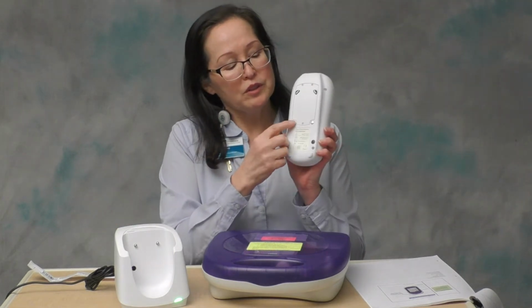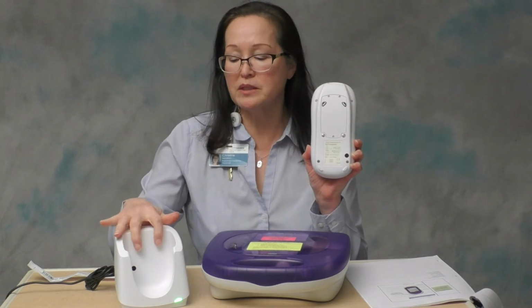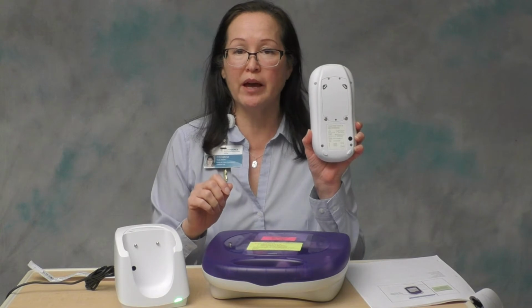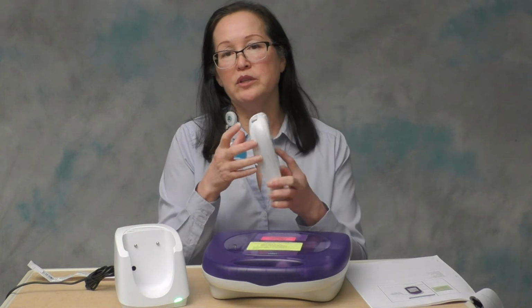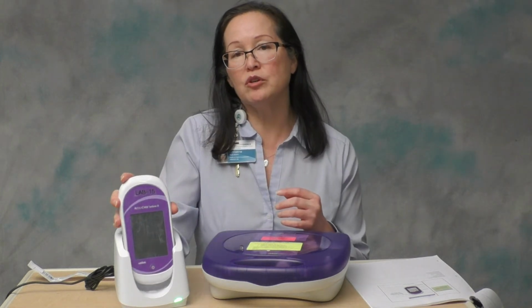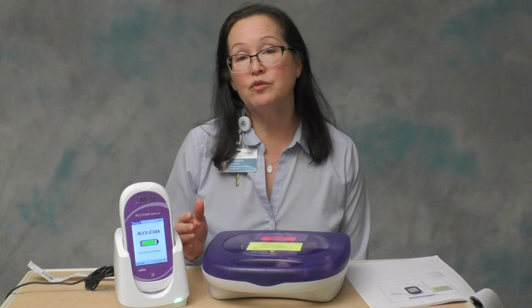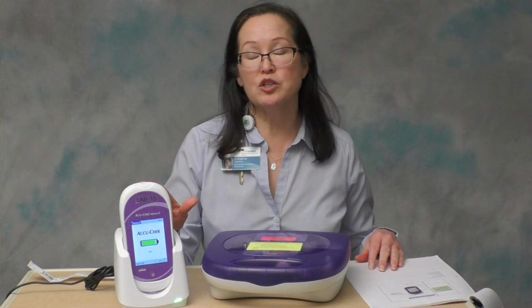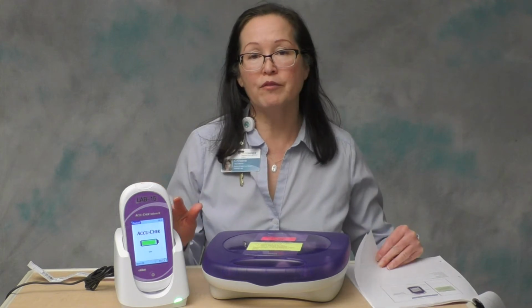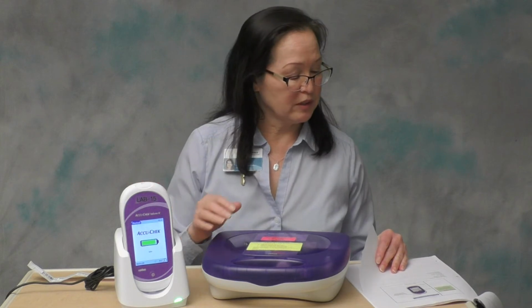On the back of the meter, you'll see two metal contacts. This is where the meter makes contact with the base to recharge the battery. This is really important to make sure that these metal contacts remain dry when you redock the instrument. If there's any moisture on the battery contacts, a rust film can develop and the contacts can start to corrode. And the rust film will actually prevent the battery from recharging correctly. So just make sure that you dry off those battery contacts anytime before you redock the instrument.